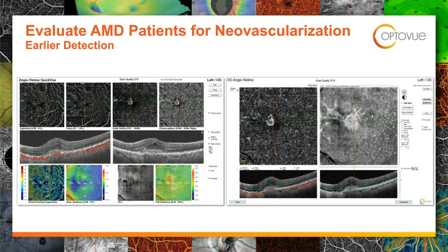If we jump over to the image over here on the right, right where the angiogram is, I actually have a custom view where I'm trying to really just highlight the choroidal neovascular membrane, but that would be down there in the retina image where there shouldn't be any blood flowing through there. So we were able to get this patient over immediately to the retinologist to get their treatment.